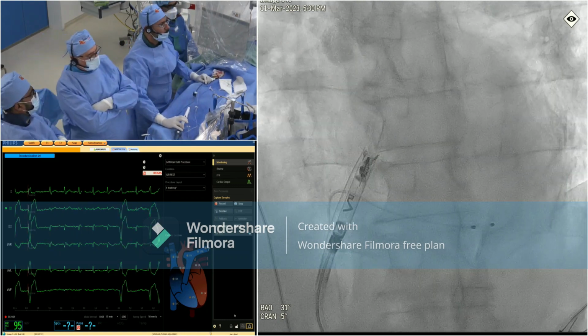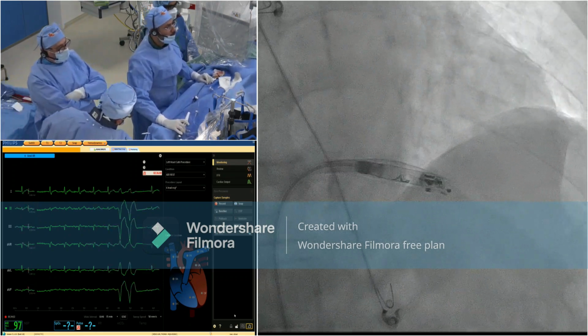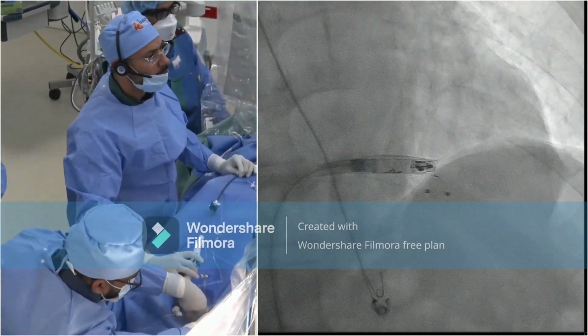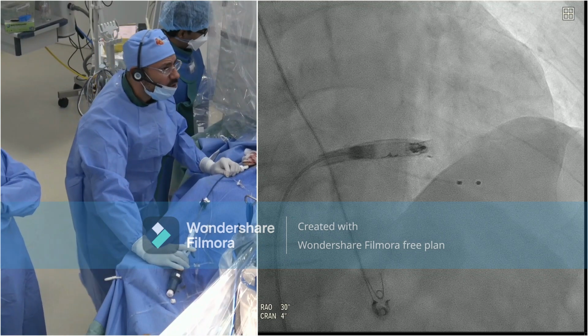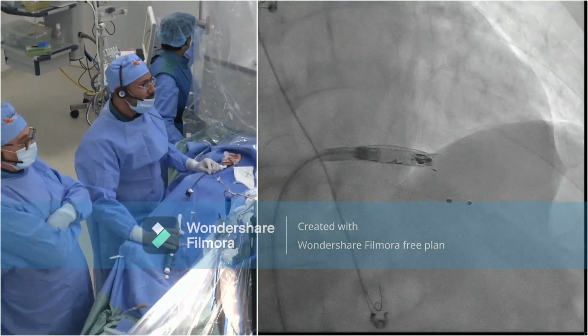We use conductive transmission, which allows us to conserve the battery, instead of inductive transmission when we communicate with the programmer, by the way. And as you can see, during manipulation, he gets very frequent arrhythmias. That's why I stop in between, to be as gentle as possible to position my catheter.